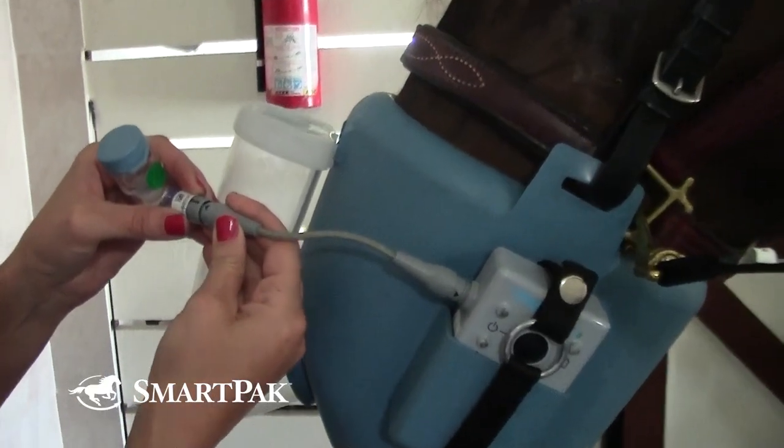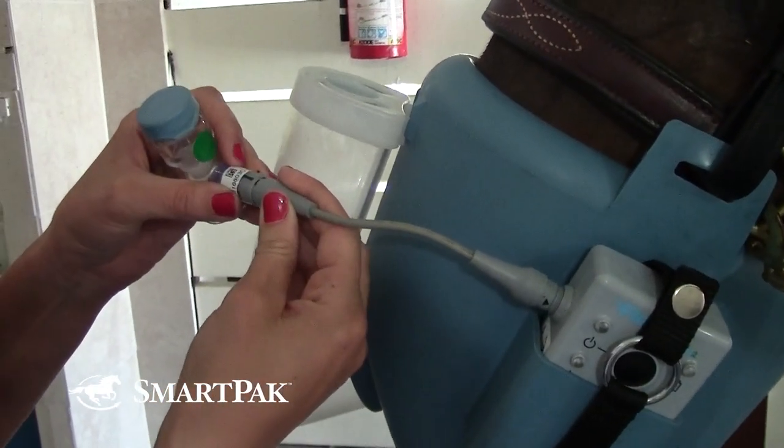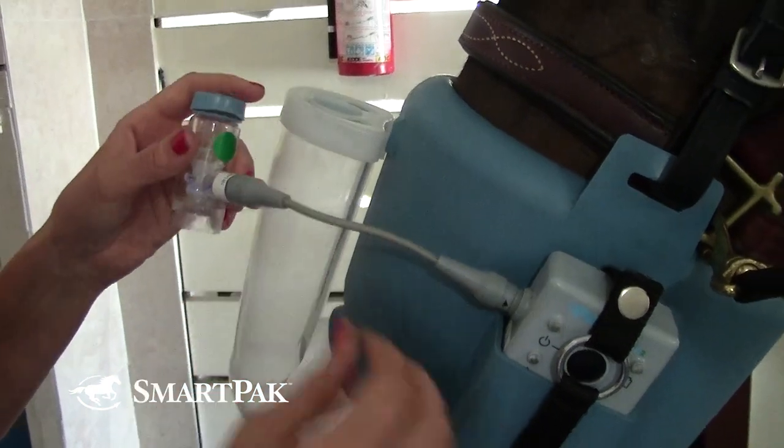While I give them the medication, they just have the nebulizer on, and I can use that time to brush them and tack them up.